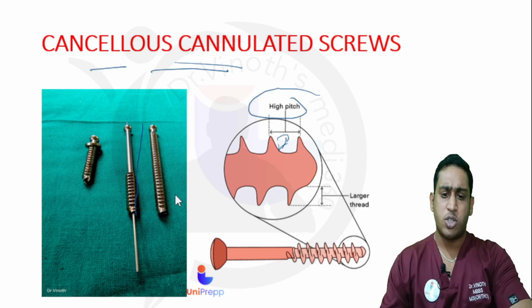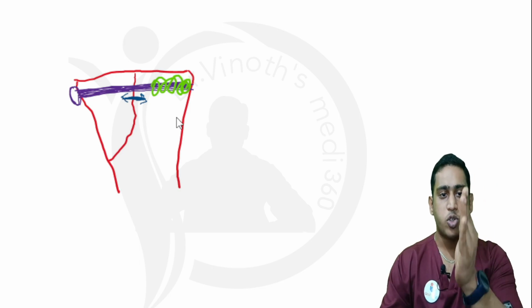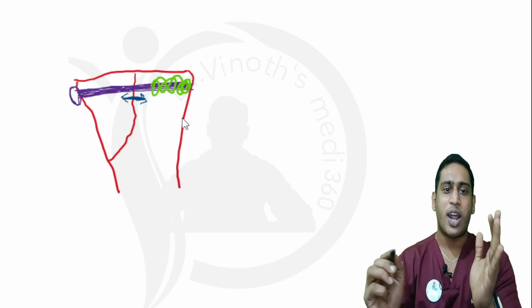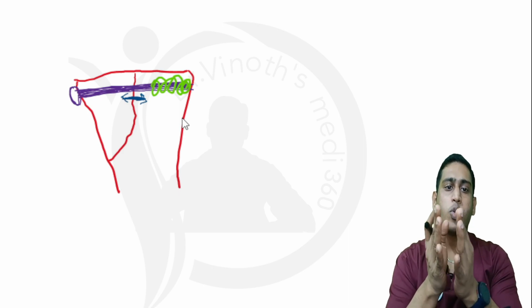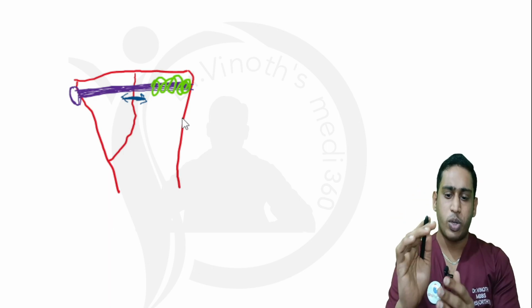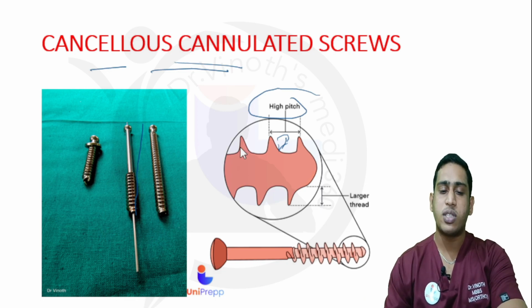So why are the CC screws used? They can be used through the plate or without the plate also. Whenever you are fixing a fracture at the articular surface, you have to apply a screw through the cancellous part of the bone, which means the subchondral bone. Then we have to apply a cancellous screw, because that will have a good hold at the cancellous bone surface.